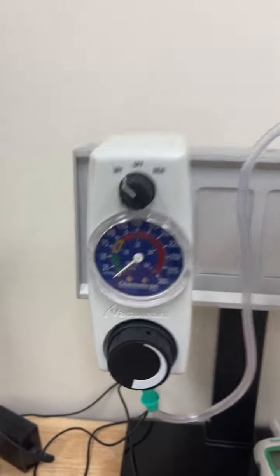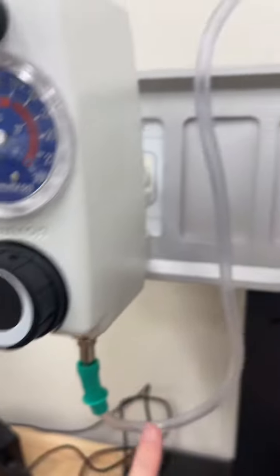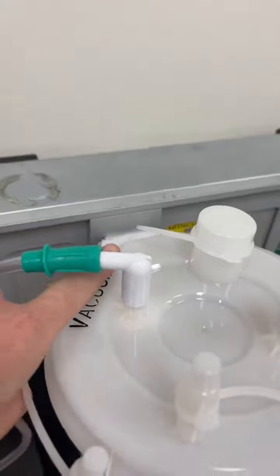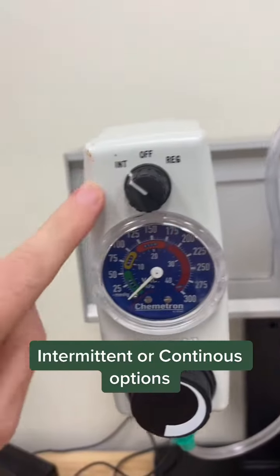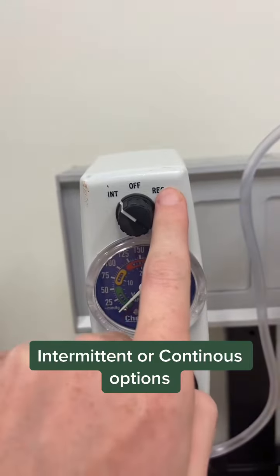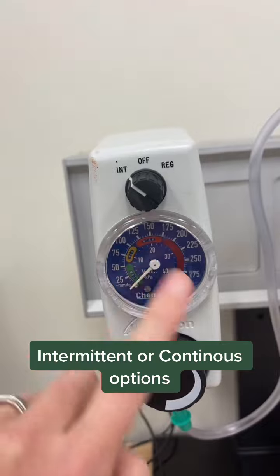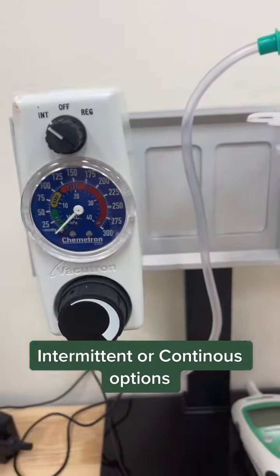So something I want you to notice, we've got this here, this tubing is connected here, and then this tubing connects to this canister. Okay, see where it says vacuum. So here is where you would adjust it. If someone has intermittent suction ordered or continuous, and then obviously off, then like low, medium, high, you would adjust for what it needed to be per order using this, okay?